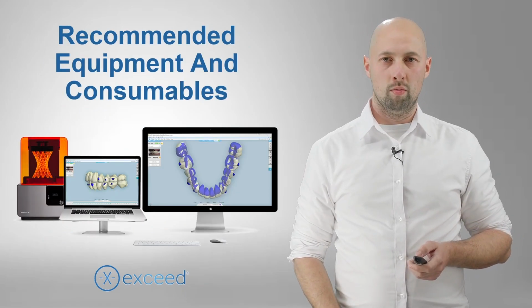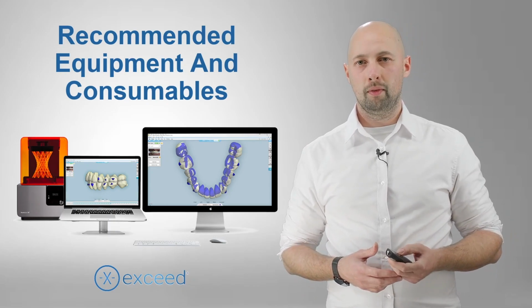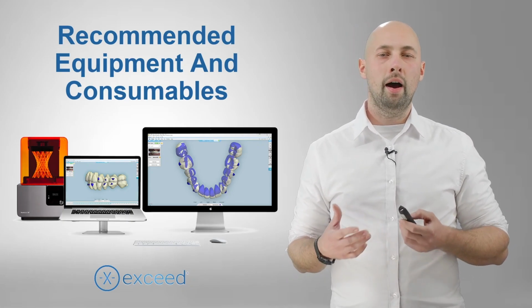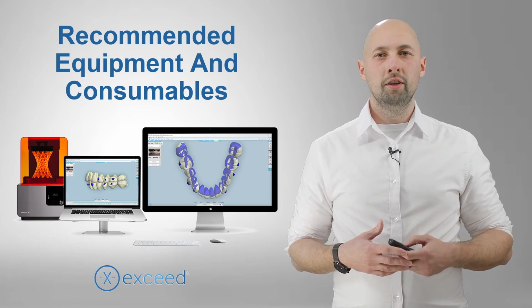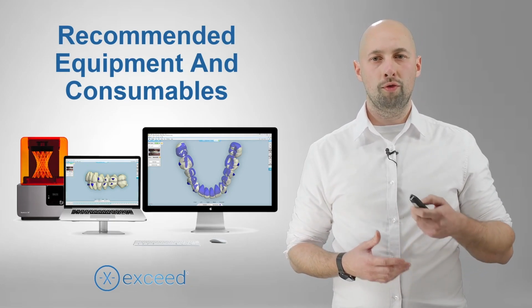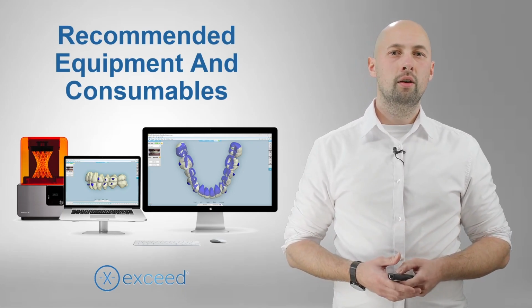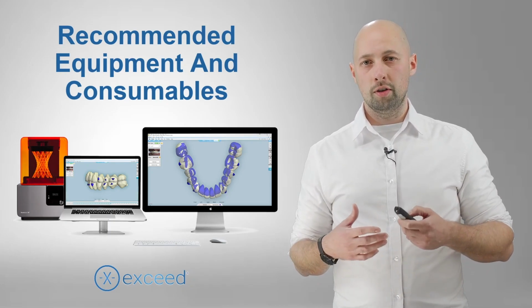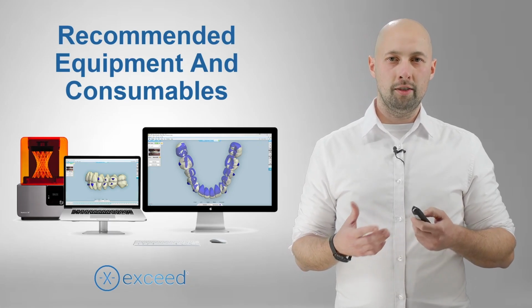Recommended equipment and consumables. To create your own aligner brand, you will need the right equipment. Here is the brief list of what you will need. First of all, you will need a high-quality 3D printer to print the models. You also will need the digital scanner for creating accurate digital impressions of your patient's teeth. They can originate from intra-oral electronic scans or even traditional dental impressions. You will also need the vacuum former, which is necessary for producing the aligners using the clear thermoplastic sheets.